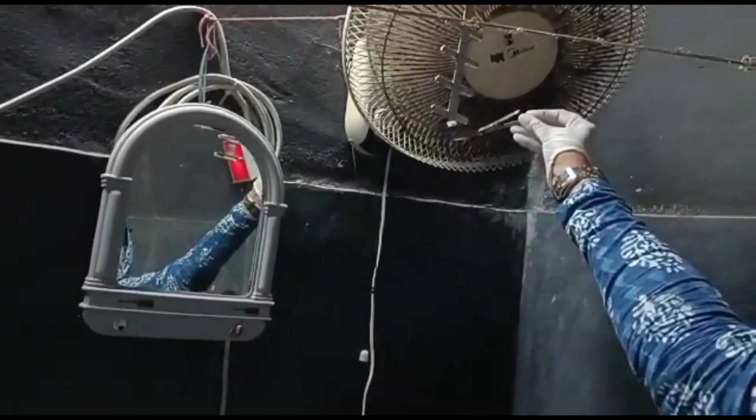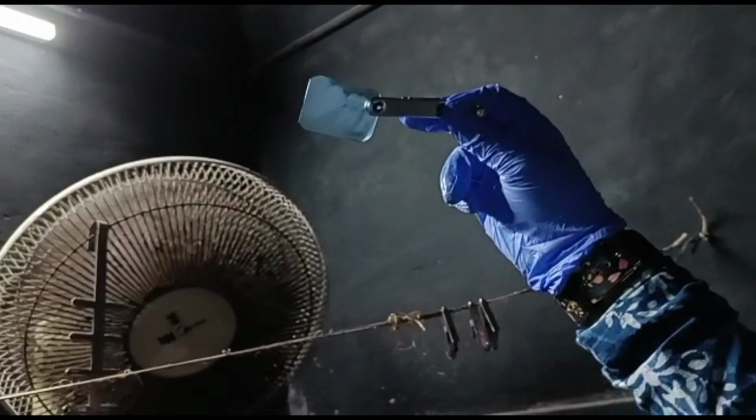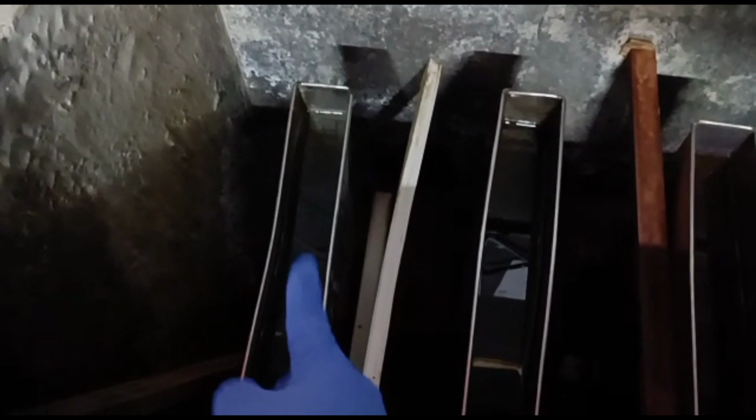Here in our setup we use the air dryer itself, and after you're done with the processing, this is the image that you get in broad daylight. So this is the developing solution, the water, the fixer solution, and that's the running water.